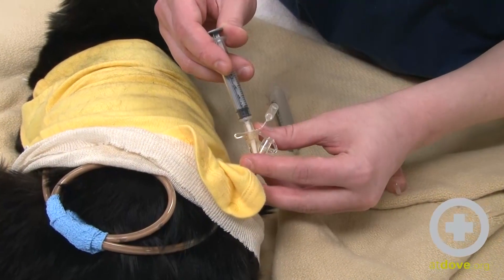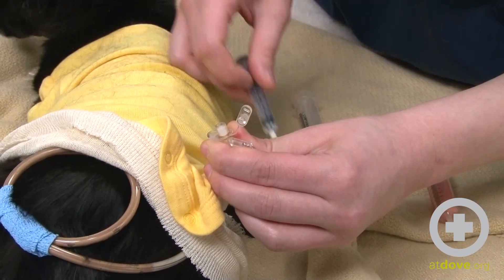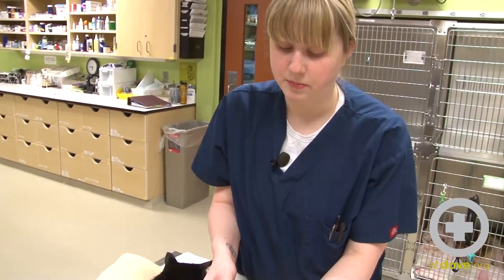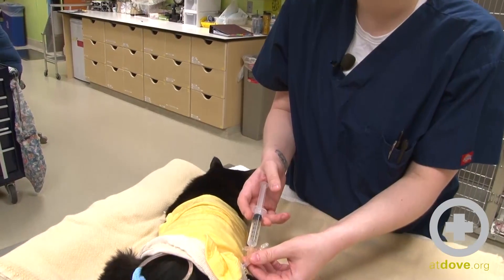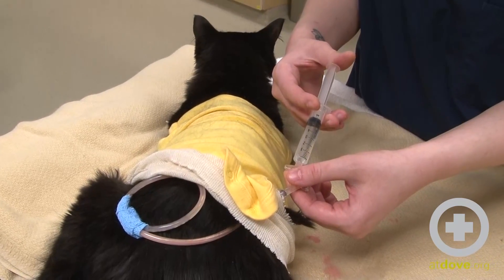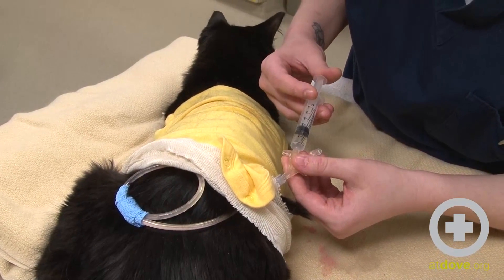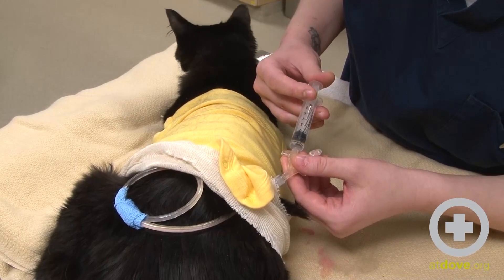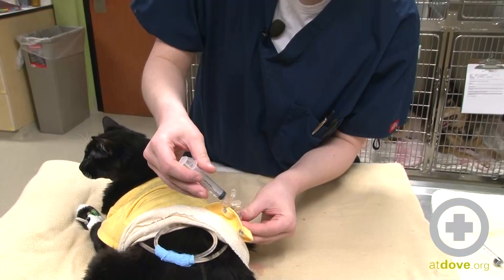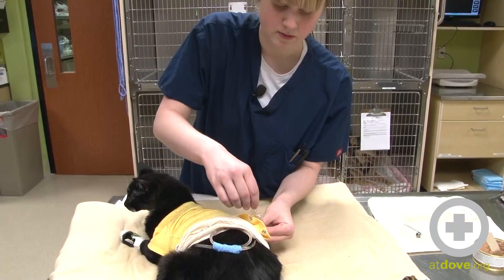When I disconnect to put the other medication on, I'm going to try to kink the tube a little bit so that the medication doesn't come back out. I've just finished giving the rest of the medication, the Batril, and now I'm just going to flush the tube clear with another six milliliters of water to make sure all that medication gets into her. I go a little bit faster now that all the food is in to make sure the force of the water pushes all the medication in so it doesn't just sit in the tube. I'm going to kink the tube again and then cap that off.